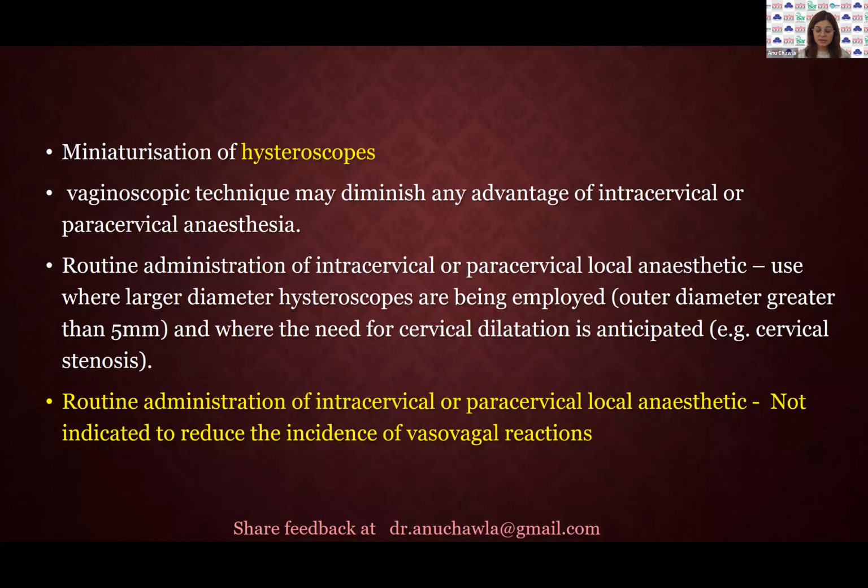We really need to focus on the size of the scope that we choose for office hysteroscopy, because the diameter of the whole system, with or without operative sheath, depending on whether we're doing diagnostic or operative, should not cross 5 millimeters if it is the system used in the office without anesthesia.